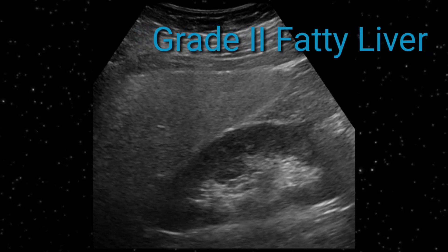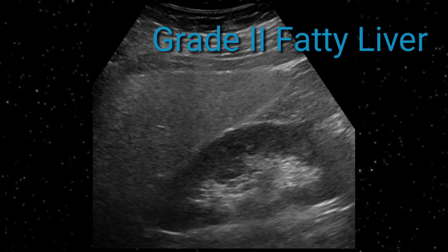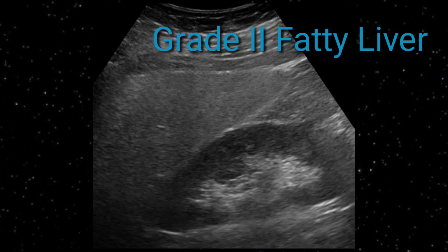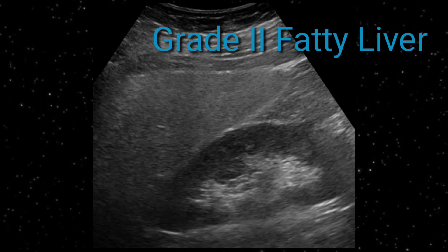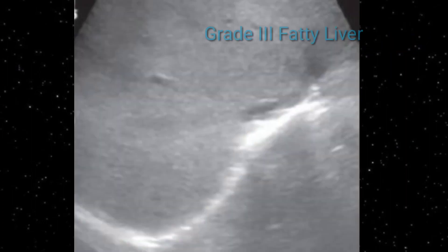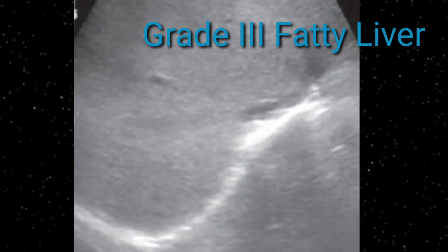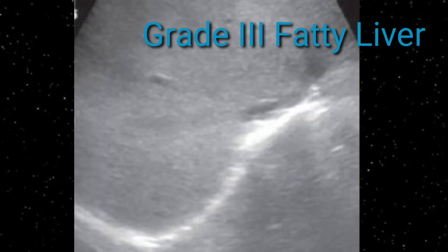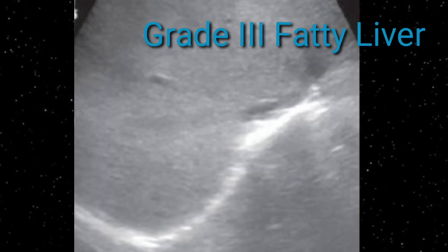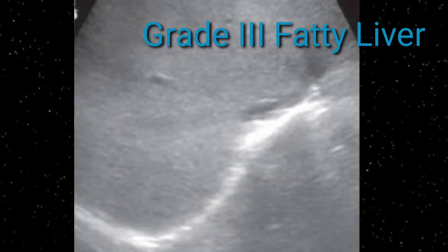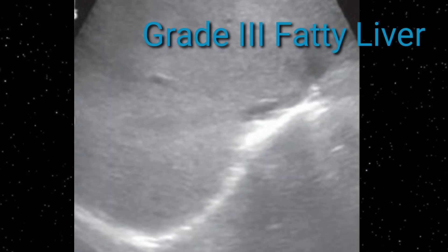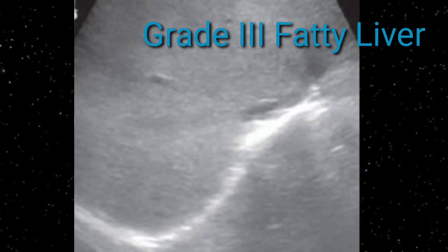This image shows Grade 2 fatty changes. In Grade 2 fatty liver, the liver appears bright and echogenic but you will rarely appreciate the echogenic wall of portal veins — portal vein wall echogenicity is not clearly visible. Grade 3 fatty liver is defined as a bright echogenic liver with a marked difference in echogenicity compared to the renal cortex. The renal cortex is hypoechoic while the liver is bright echogenic, and no differentiation between portal veins and hepatic veins is visible.